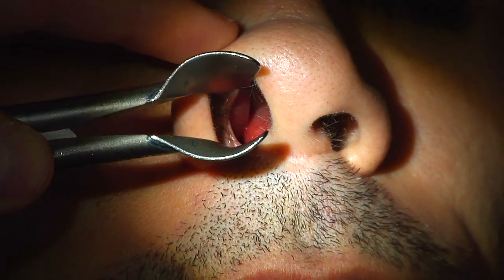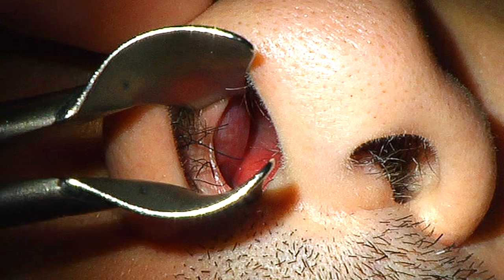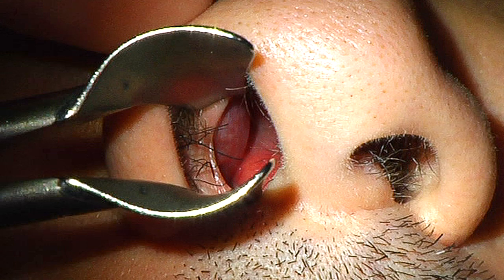I'm going to look on the inside of your nose now. In examining the nose, one first encounters the nasal vestibule, which usually has a similar skin tone as the patient's. There are hairs in the vestibule, known as vibrissae. The vestibule, because it has hair follicles, may develop infections, as does the skin.